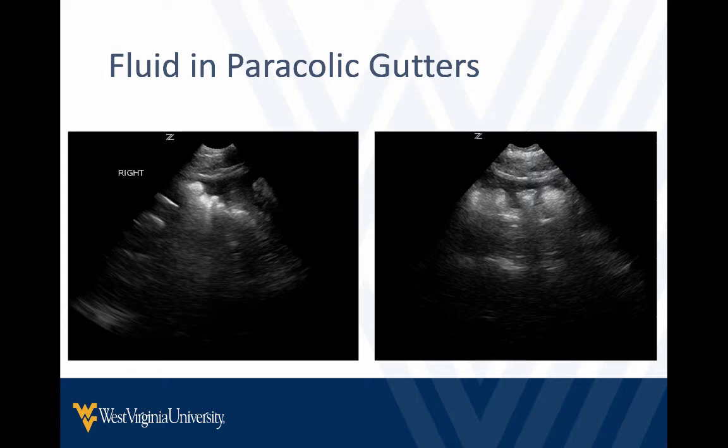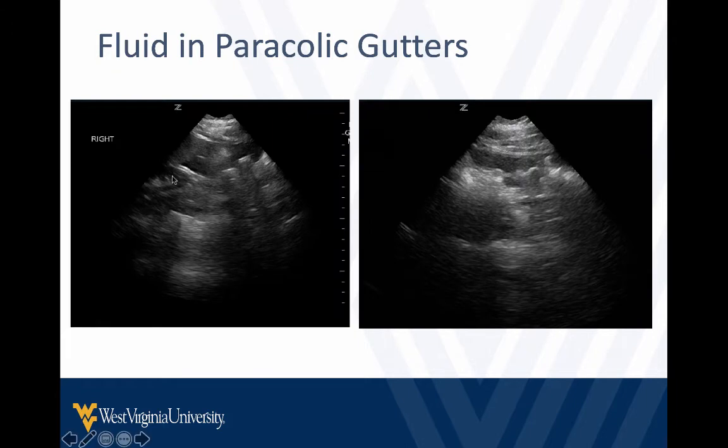That's what we're looking for. You may do the exact same thing in a patient where you suspect ectopic pregnancy. Just some more examples. So we can see the lower pole of the kidney here, and we actually see the fluid kind of stops right at that lower pole. So if we didn't include the paracolic gutter, we might miss this fluid.